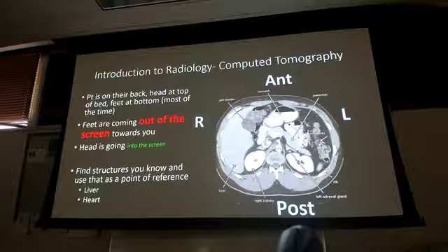right. That doesn't work, like we talked about, if I have one wrist, or one hand, or one forearm, or one elbow, because I don't have anything else in the torso area on the imaging, or the abdomen, or the chest, or whatever you want to call it, to help me understand this whole right-left thing if I just have a singular bone, or a singular knee, or something along those lines. Right? Because I have nowhere to orient myself. But if I have the whole body, that's how that works. Questions on that? Does that make sense? Okay.